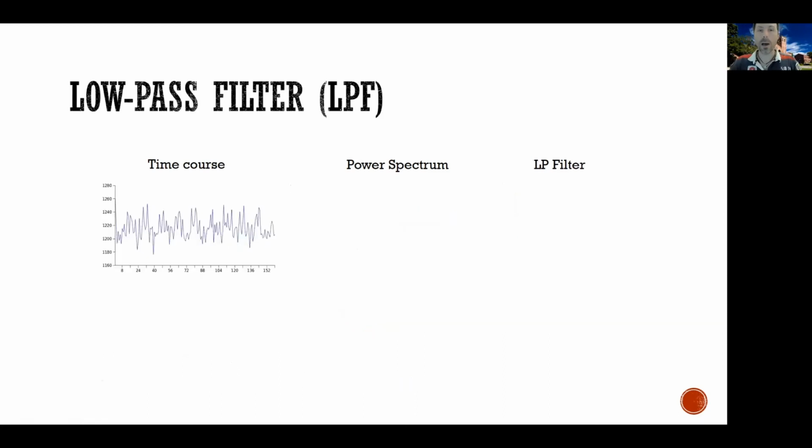Of course, you can get the opposite problem: too much high-frequency noise. And sometimes, I should say, low-frequency noise sources get aliased to high frequency. So sometimes heartbeat or respiration, which might be pretty slow, appear like high-frequency noise, just because they get aliased into higher frequencies. So if you were to take the power spectrum of this, what you would see is this. Now, this is my task, as usual.